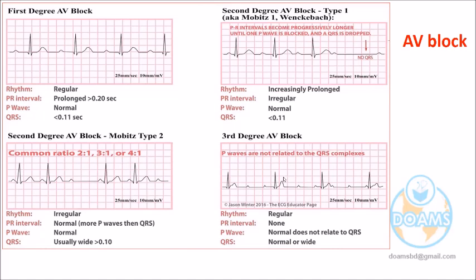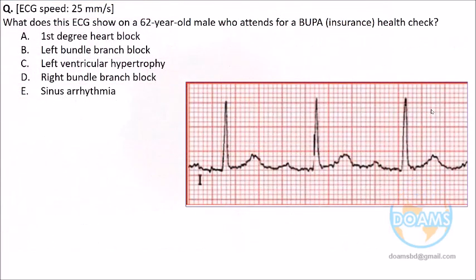If you are confused, calculate the heart rate here. RR, around 40 usually is found. A question to you now. Try to give the answer, please. I hope everybody can give the answer.